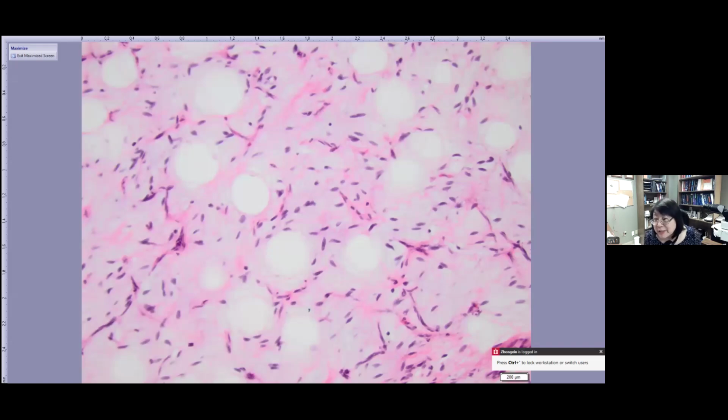So very important. Yeah, that's a great contrast to be aware of, and obviously a pitfall. If you don't know the history or the age group, you could easily get led down the wrong line.